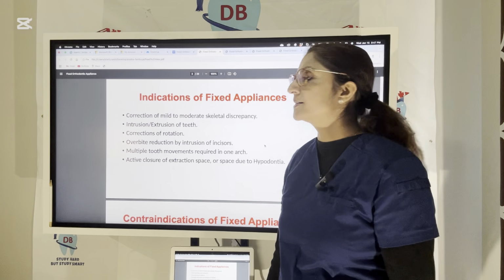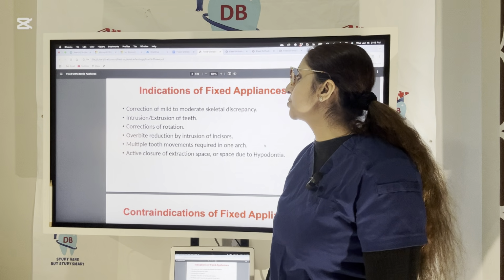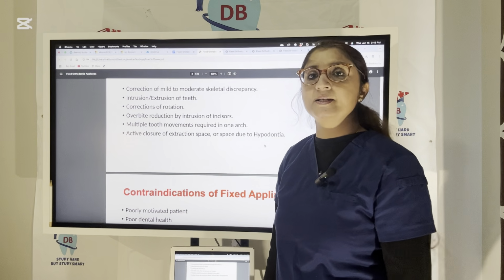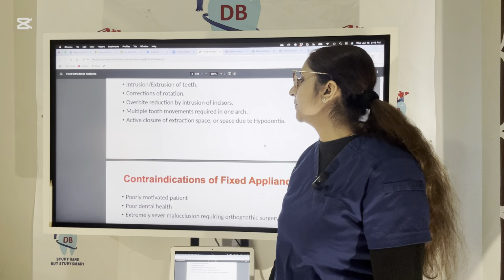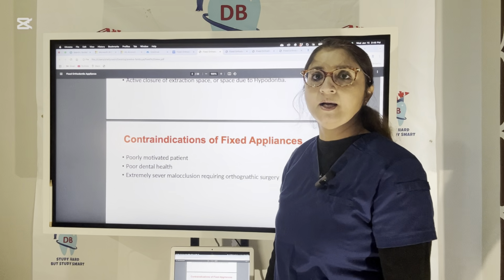Fixed appliances are used for correction of mild to moderate skeletal discrepancy, intrusion, extrusion of teeth, correction of rotations, overbite reduction by intrusion of incisors, multiple tooth movement required in one arch, or active closure of extraction space or space due to hypodontia.